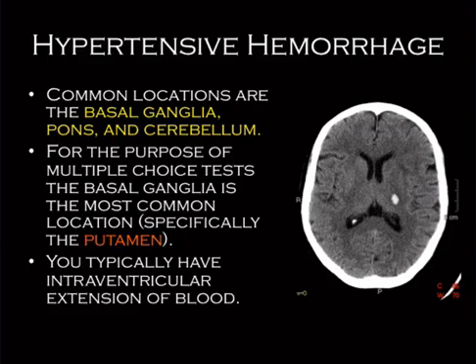So the hypervascular mets stay hypervascular when they go to the head, and they can bleed. And if they were going to show a case like that, they would have to show you T1 post-contrast imaging to look for an underlying mass.